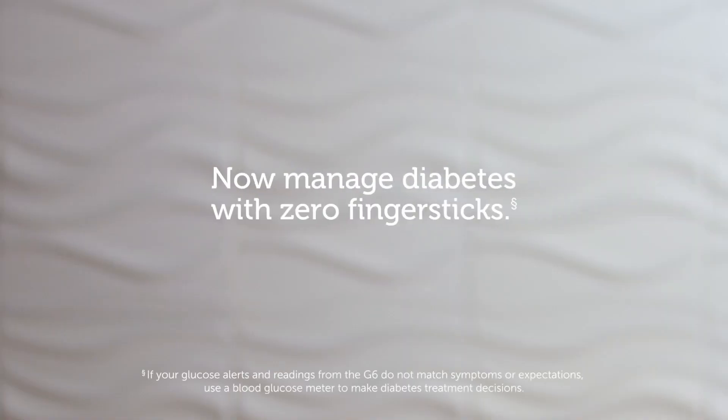So much information just by glancing at your smartphone or receiver. With the Dexcom G6, you can manage your diabetes with zero finger sticks — yes, zero. It is approved to let you make treatment decisions based on the glucose number you see on your smart device or receiver.